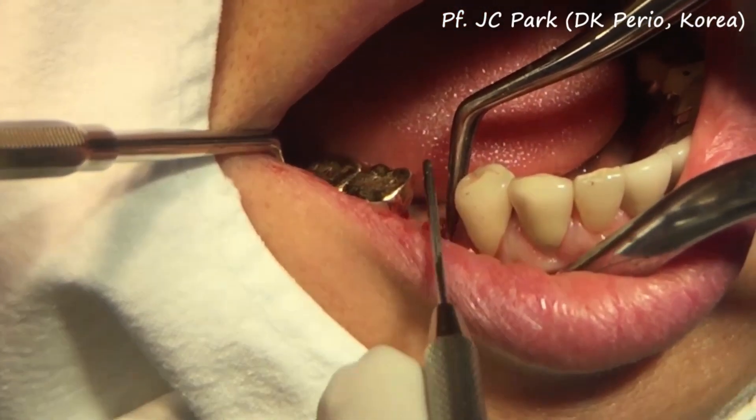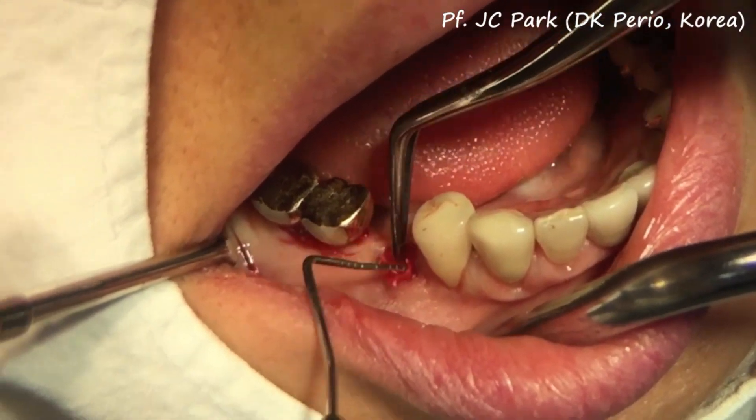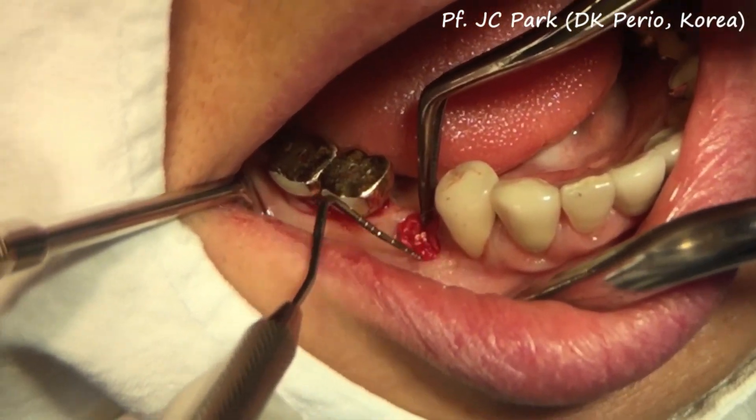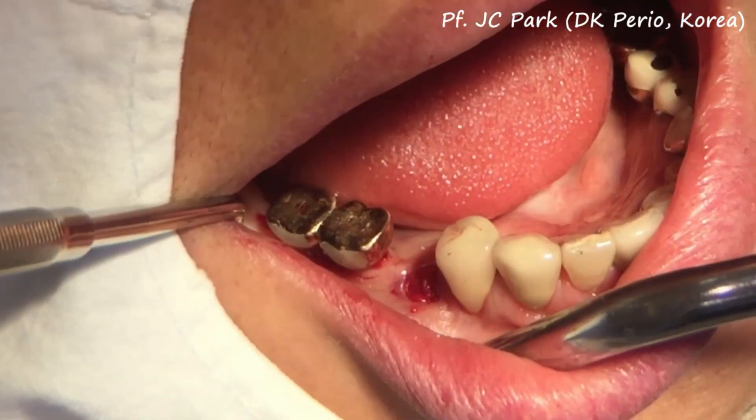After the application of the collagen membranes in two layers, no further manipulation is required. It will cause more trauma if you try to push the membrane under the flap.